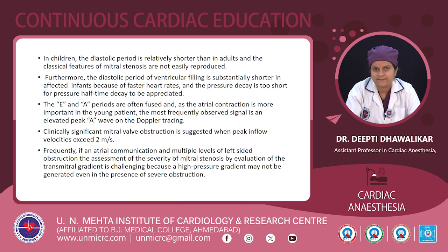In children, the diastolic period is relatively shorter than in adults, and the classical features of mitral stenosis are not easily reproduced. Furthermore, the diastolic period of ventricular filling is substantially shorter in affected infants because of faster heart rates, and the pressure decay is too short for measurement of the pressure half time to assess the severity of MS. The E and A periods are often fused, and the atrial contraction is more important in the young patients.